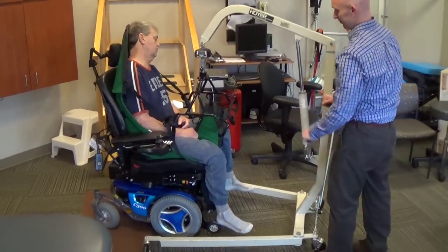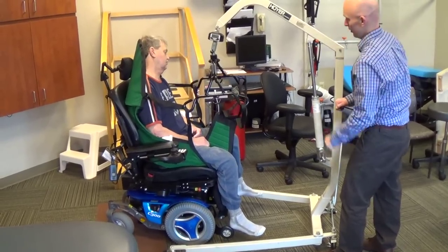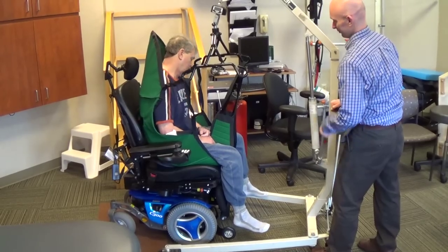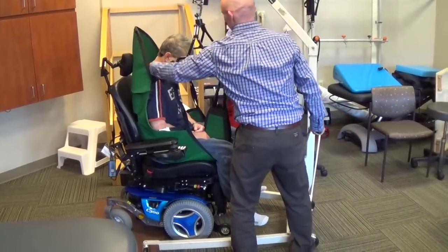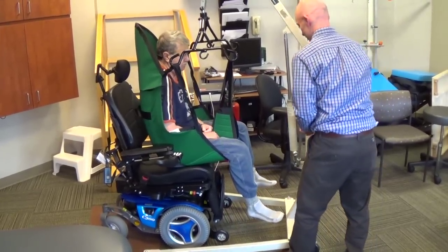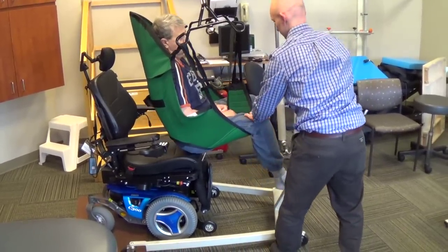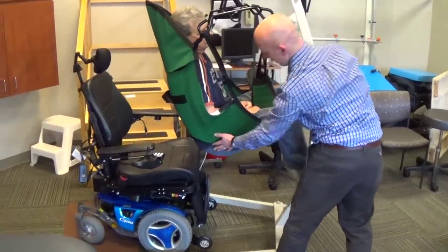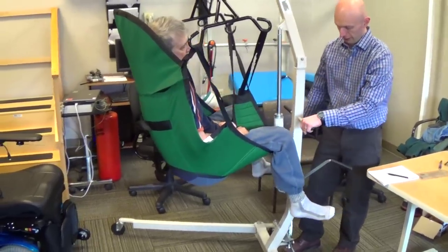Next, I'll just secure the brake. And I'm just watching to make sure none of the straps are hooked on the wheelchair armrest. And just being mindful too that the person's feet do not hit the bar. We're clear out of the chair. I'm going to pull the lift back. It's easier to maneuver the chair with the base narrower.